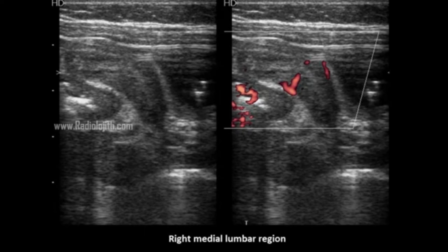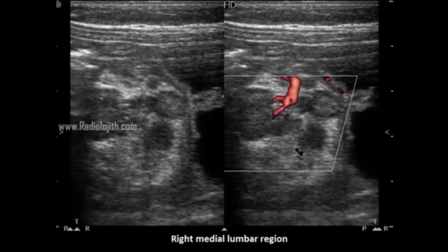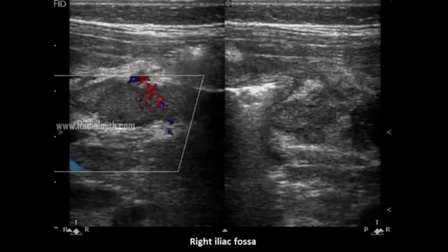The first image is through the right medial lumbar region in longitudinal axis. The second image is the same right medial lumbar region in short axis. The third image is in long axis in the right iliac fossa.